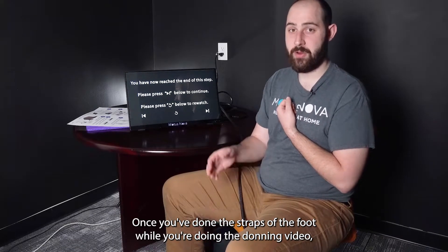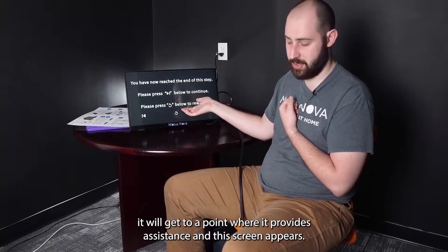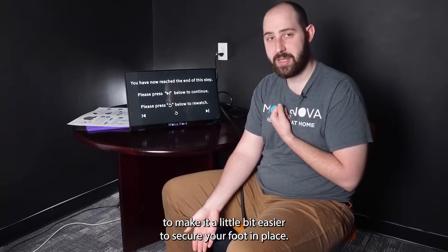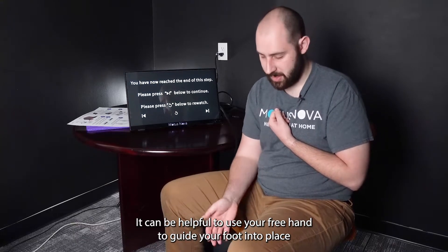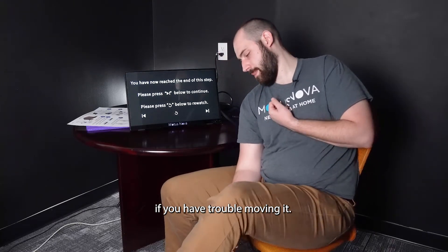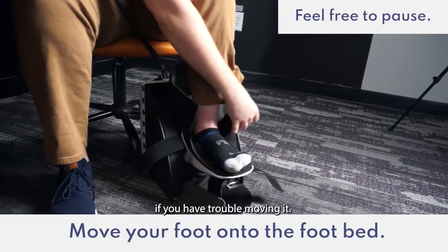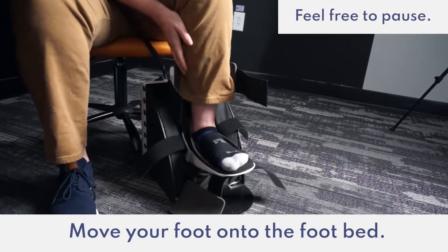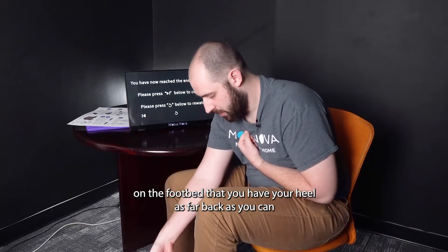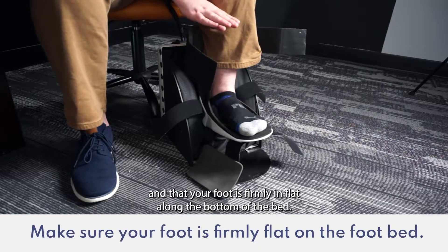Once you've undone the straps of the foot while you're doing the donning video, it will get to a point where it provides assistance and this screen appears. At that point, you can put your foot onto the footbed. It will provide assistance to make it a little easier to secure your foot in place. It can be helpful to use your free hand to guide your foot into place if you have trouble moving it. It's important that when you put your foot on the footbed, you have your heel as far back as you can and that your foot is firmly and flat along the bottom of the bed.